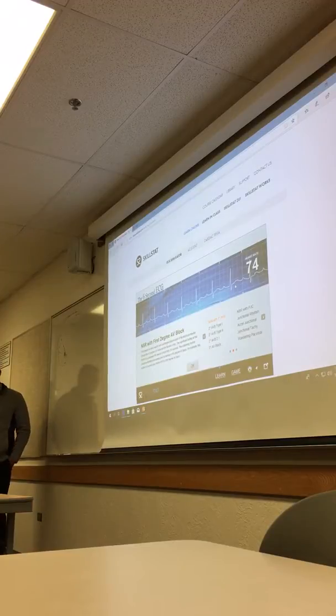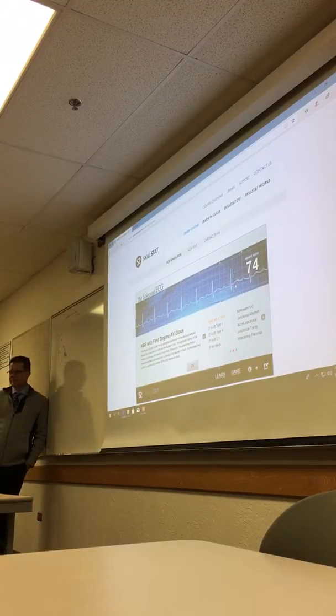So with just that PR interval on normal sinus rhythm, the PR interval should be less than 0.2 seconds, because that's five boxes. So what's the normal for a PR interval? Do you remember? 0.12 to 0.2. So 3 to 5 boxes is what your PR needs to be.